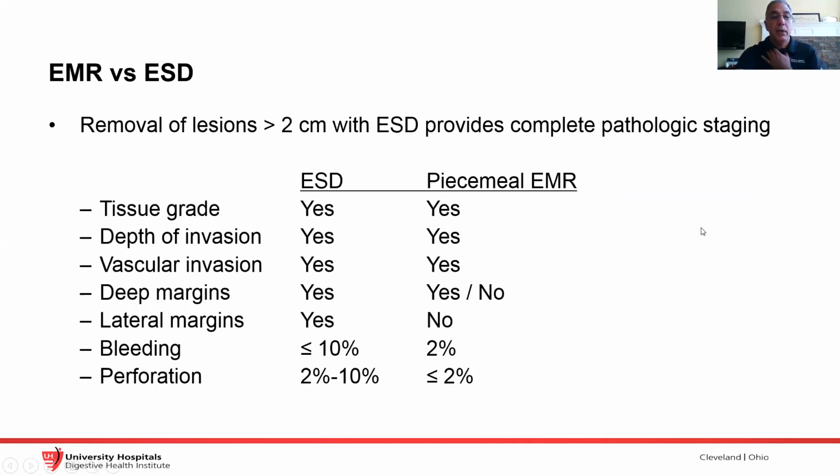And comparing EMR versus ESD, basically ESD provides everything except for a low complication rate, and piecemeal EMR fails to give us deep margins in a significant number of cases, and there's no way for a piecemeal EMR to provide lateral margins.